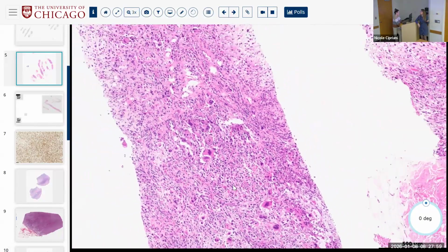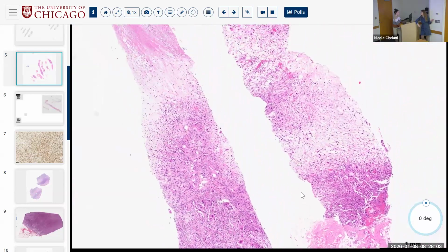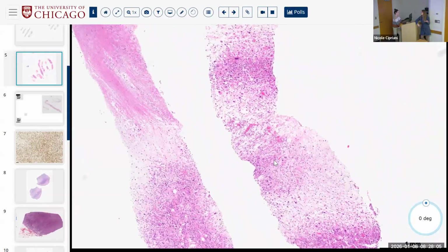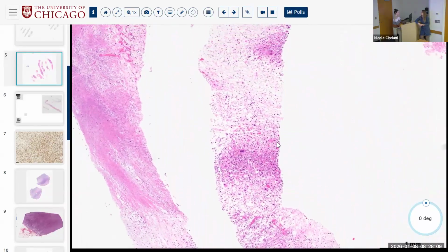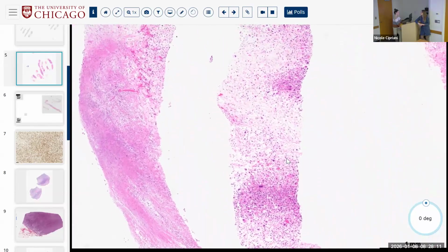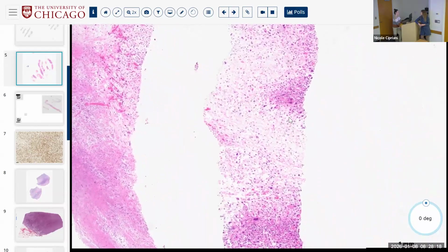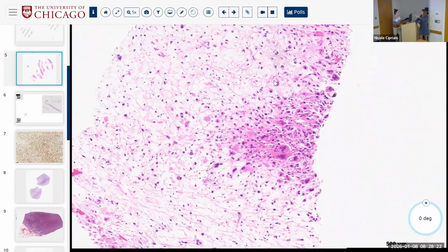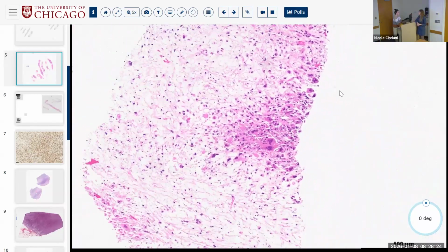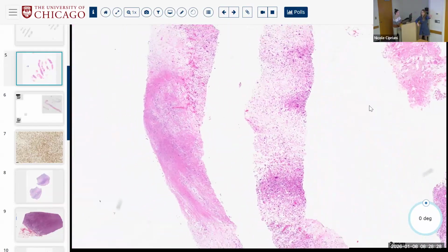Would you be expecting loss or retention if this chromatin was affected? Loss, right? So in this case, it would be retained. If you're thinking about INI1, BRG1 lost tumors, what is the morphology usually of them? Is it more spindled or more epithelioid? Usually more epithelioid, so we're thinking more epithelioid sarcoma. This doesn't perfectly fit, but with that rhabdoid appearance, you want to throw it in. All right, so none of those have panned out. What are we left with?